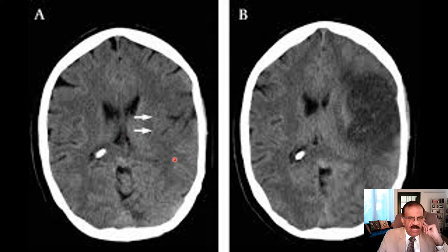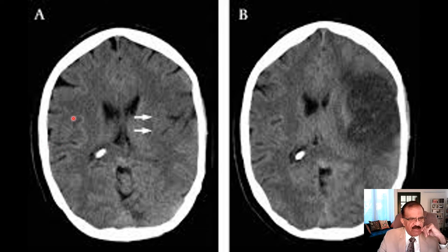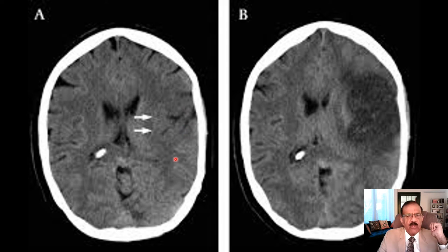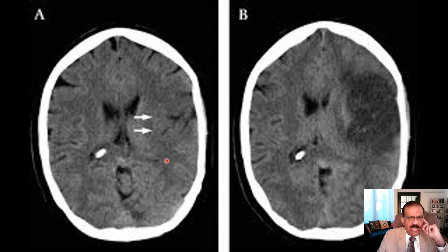Going back to the initial CT scan and examining it more carefully, you would appreciate that this area is not exactly normal — the demarcation between white matter and gray matter is quite well defined elsewhere, but this part has lost the normal demarcation between gray matter and white matter. That should make you suspect a problem here, particularly when you correlate with the history.